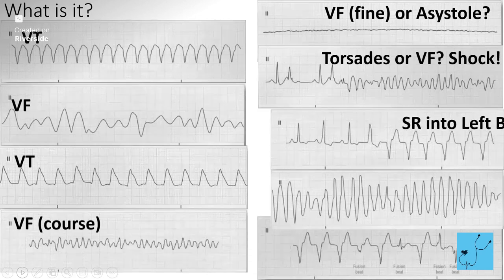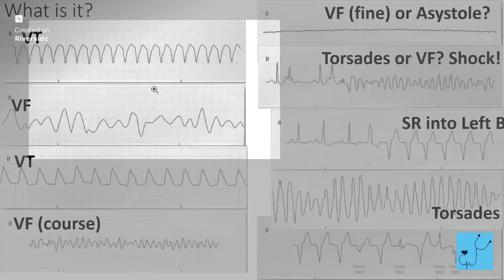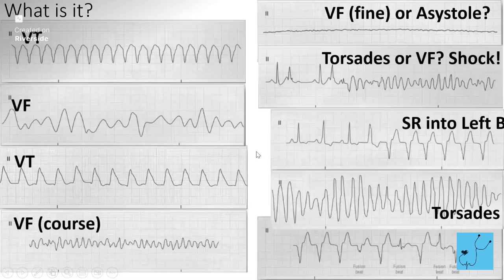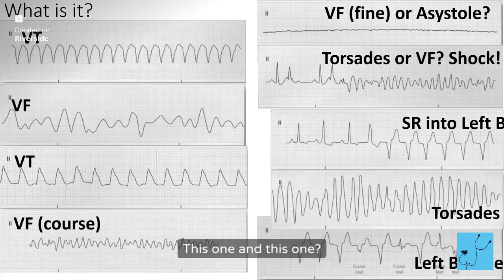What about this one? Yeah, definitely a torsades. What do we have here? The bundle branch block. Okay, left bundle. I get confused with this one and the second one. Yeah, this one and this one.